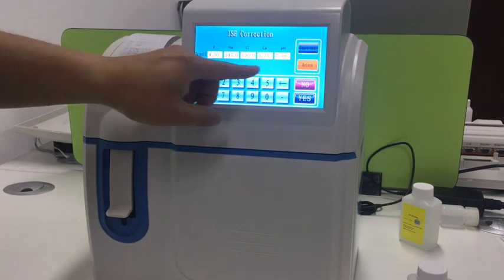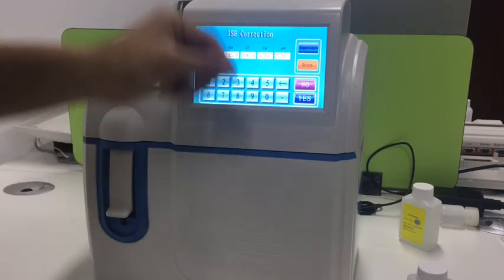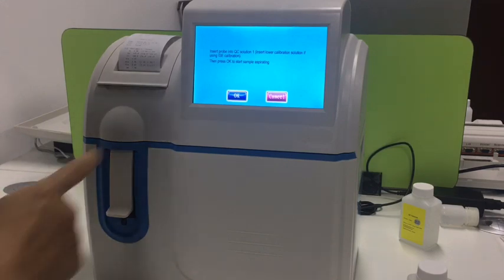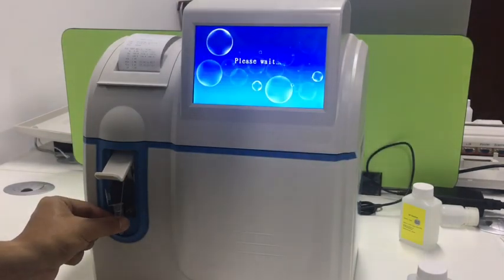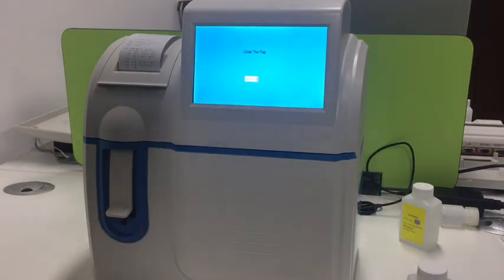These are the values I already imported. Now we press test. When we get the prompt message, we feed the QC solution to the sample probe, then press OK and close the flap.